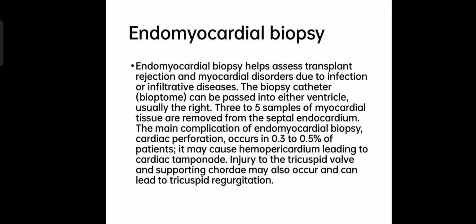Endomyocardial biopsy. Endomyocardial biopsy helps assess transplant rejection and myocardial disorders due to infection or infiltrative disease. The biopsy catheter can be passed into either ventricle, usually the right. Three to five samples of myocardial tissue are removed from the septal endocardium.